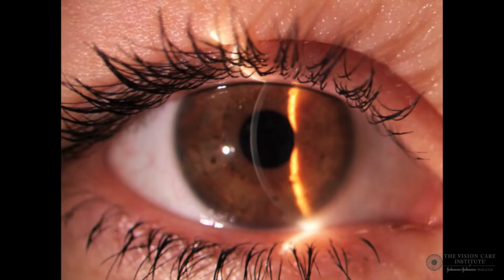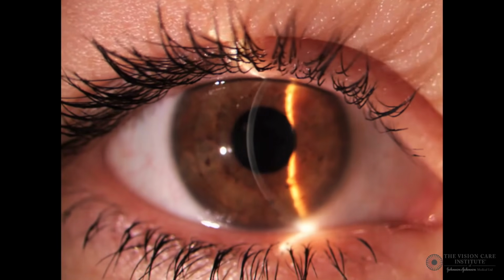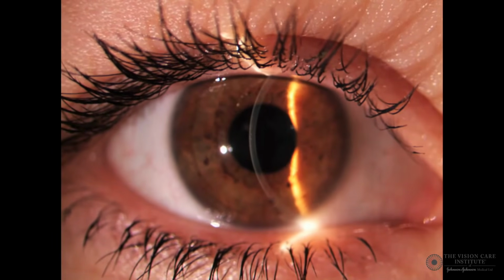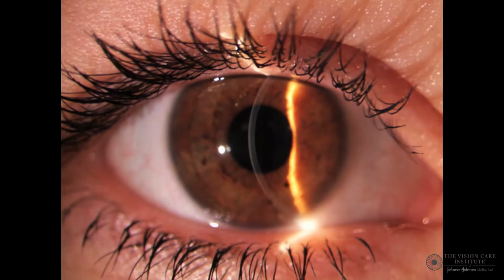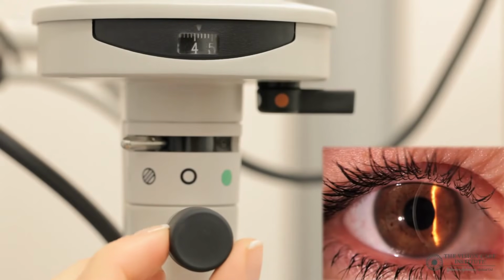Here on the real eye, we can just about see those layers, but we can see that the upper and the lower part are not in focus due to the curvature of the cornea. To overcome this, we can reduce the height of the slit so that all of the corneal section is equally in focus.